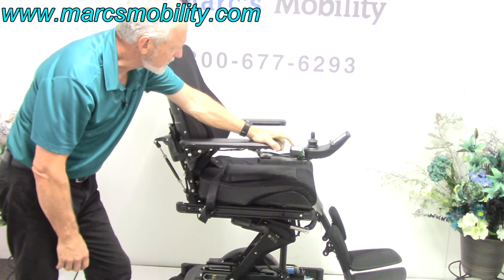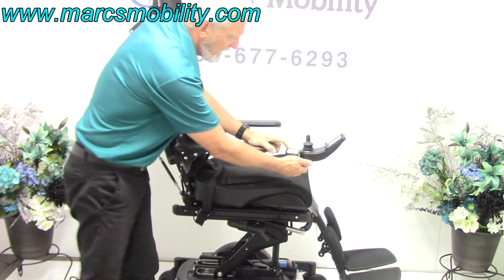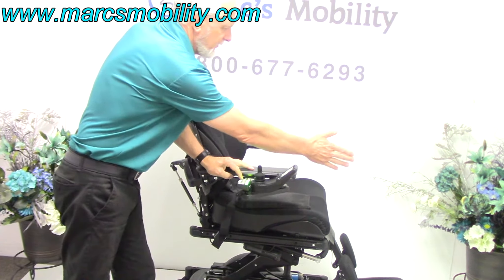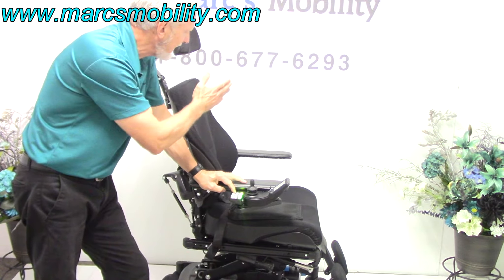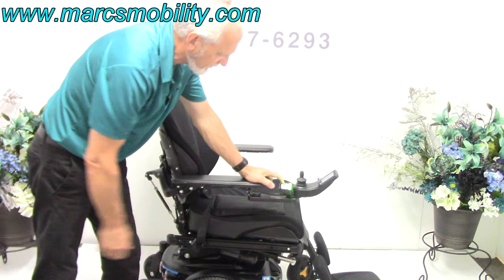That's your 12-inch seat lift — I'm going to bring it back down. You've also got what's called a swing-away joystick. It swings from the front to the side if you need to get to a table. If you're left-handed, we can switch everything to the left side, no problem at all.